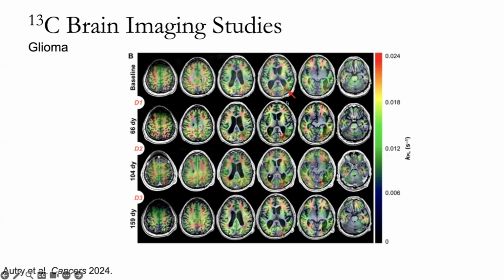And with pathology, we have consistent kPL potential abnormalities correlating with the site of prior disease. So very exciting things coming up that I think we'll see much more of in the coming years.